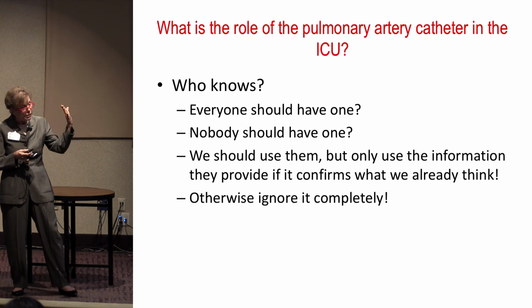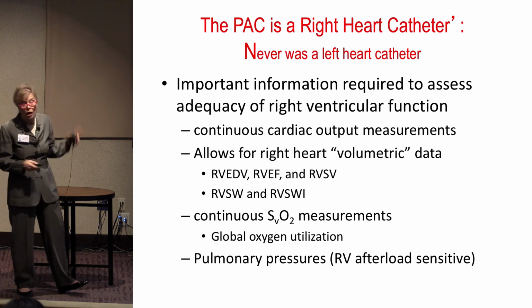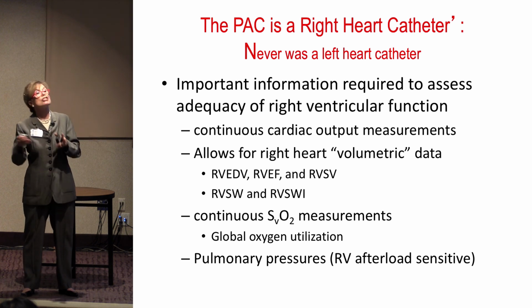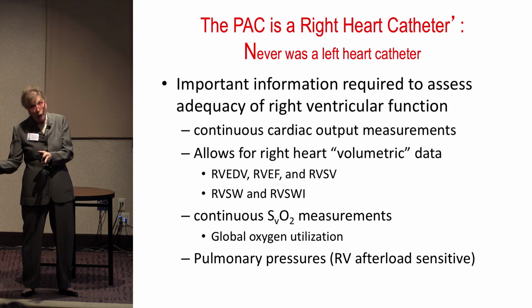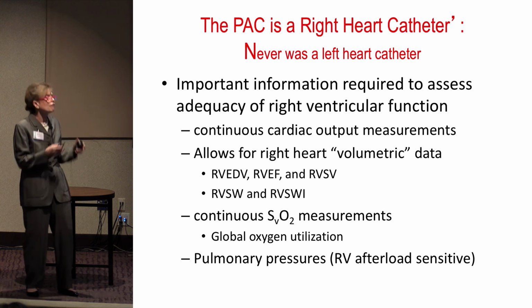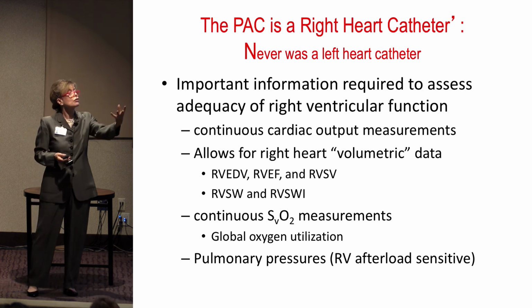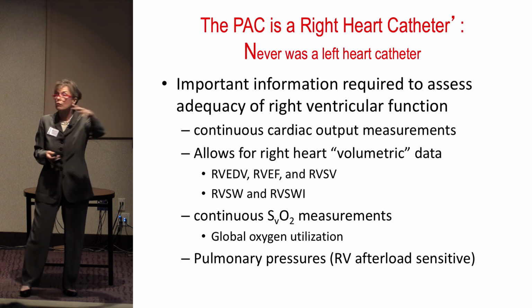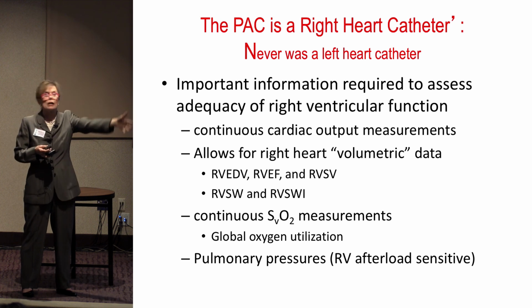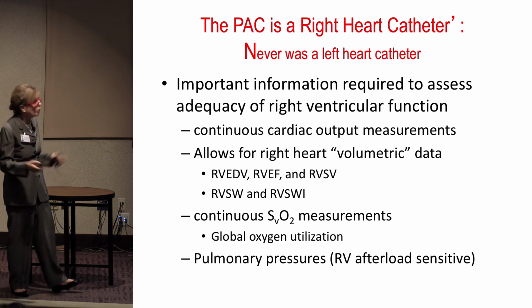So I want to remind myself that the PA catheter has a lot of value when used in the right place. It never was, and isn't now, a left heart catheter. Even when you inflate the balloon, you're still on the right side of oxygen exchange. It's a right heart catheter. Trying to make it fit for the left heart works beautifully if you've got a patient who is not on a ventilator, or somebody who's on a ventilator with very low positive pressure and a low PEEP. Then you can use your wedge pressure, your PAD, to predict left heart filling. But it's not about volume. It's about volume and compliance. So very important when we're looking at that.